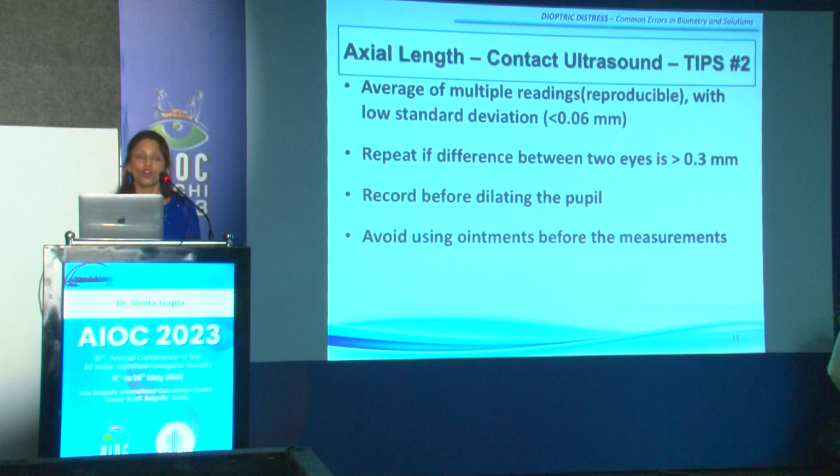Avoid using any ointments, or if the patient is on ointments, please ensure that the readings are taken a few hours after instillation of the ointment.